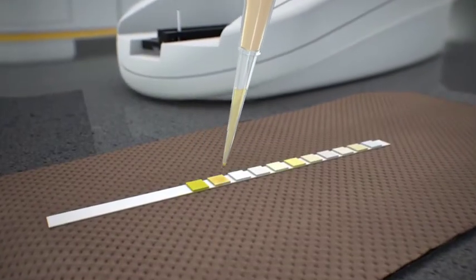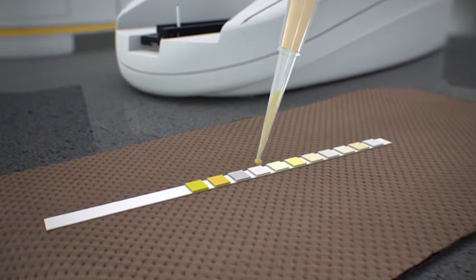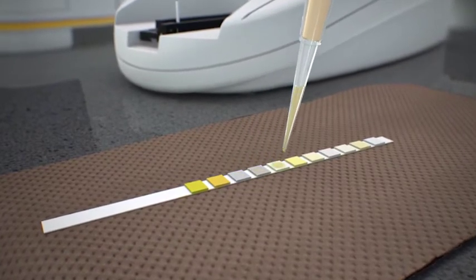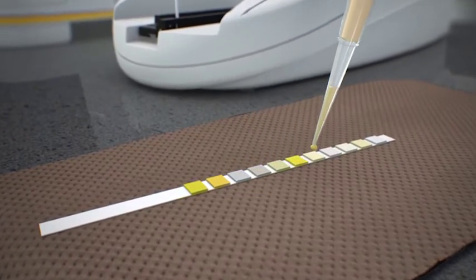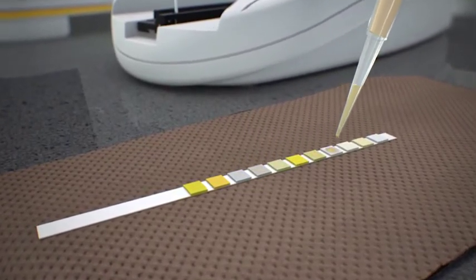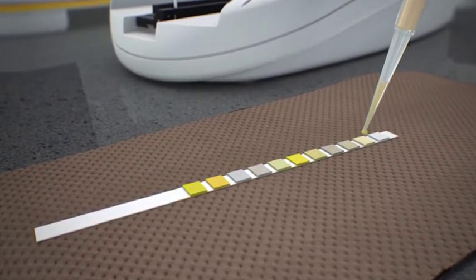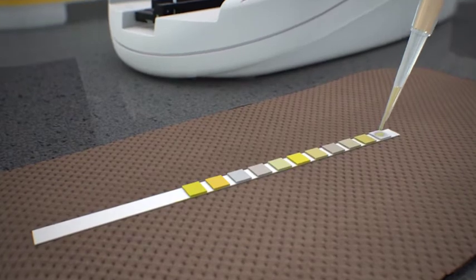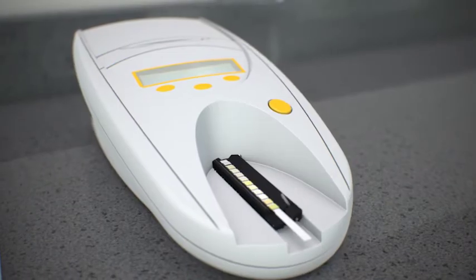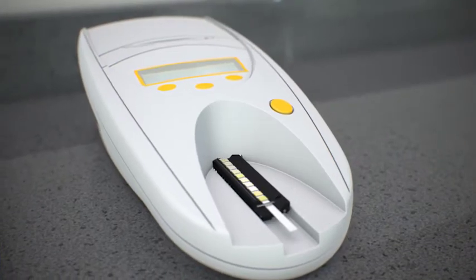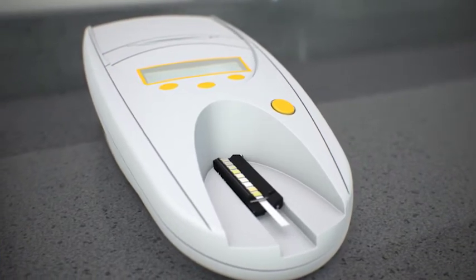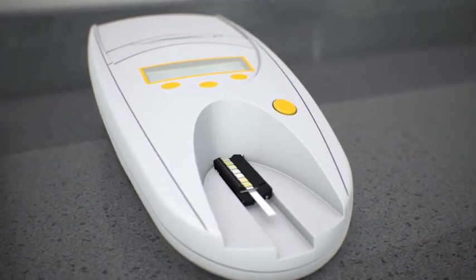While the SetiView DX is running, you can prepare the urine chemistry strip. Load into the UA analyzer and press Start. The UA analyzer will document your results after 80 seconds.